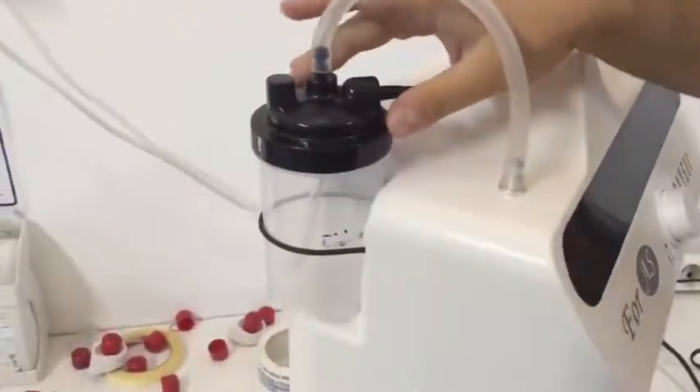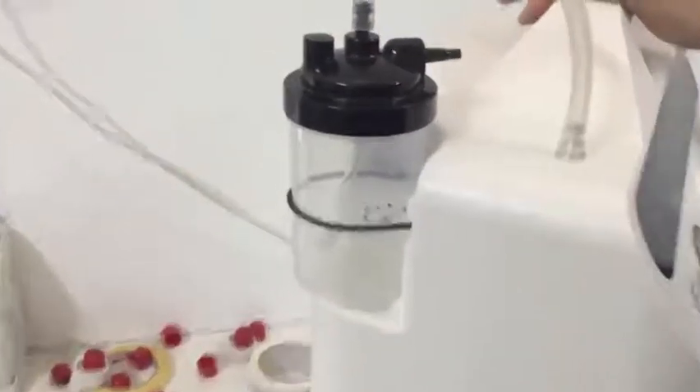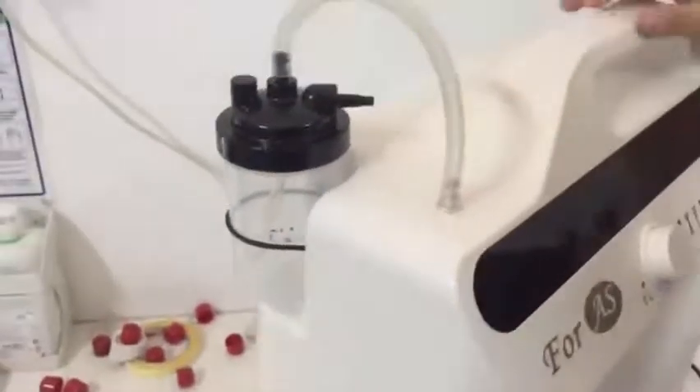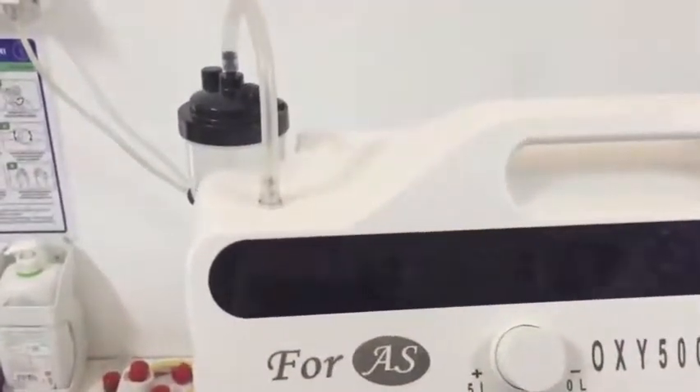There are some preparations to be done. You must put distilled, pure, or boiled and cooled water into the water box, between the maximum and minimum levels depicted on the box. We do not advise you to use tap water, for the health of the patient.